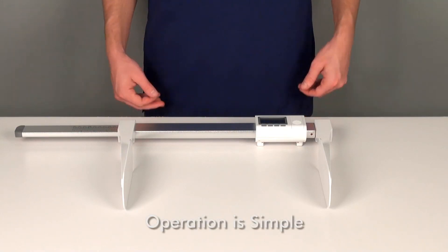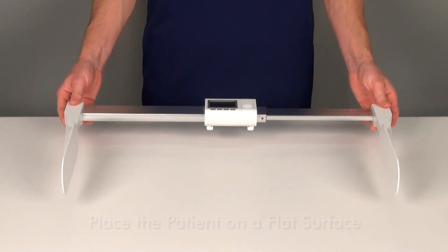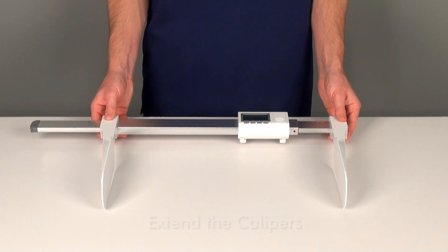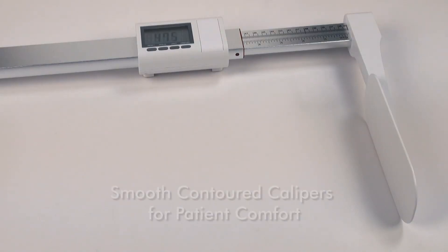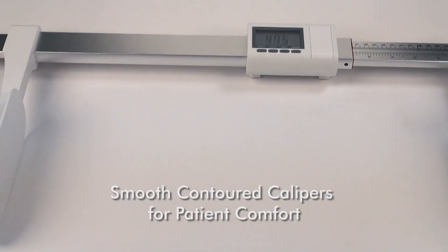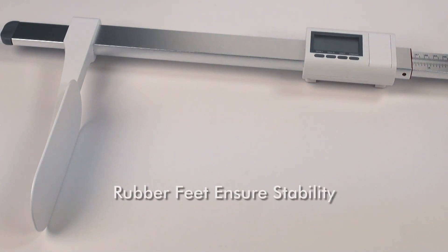Operation is simple. First, place the infant on a stable, flat surface. Then, extend the caliper out an ample amount of room above and beyond the patient's head for clearance. Place one caliper against the top of the infant's head and the other against the soles of their feet. The DLM is equipped with smooth, contoured calipers that are gentle on young patients, and rubber feet on the bottom of the stadiometer ensure stable footing during measurement.